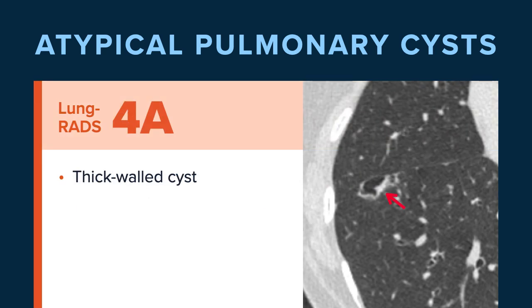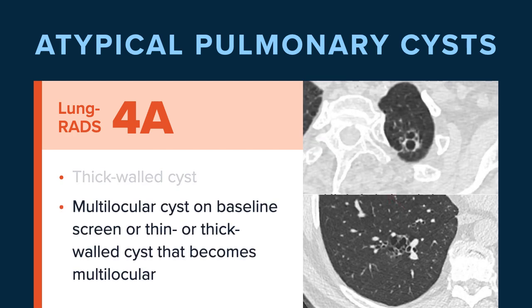IV-A lesions are thick-walled cysts. As we see in this example, we have a unilocular cyst that has a thick wall of more than two millimeters — this is a thick-walled cyst and it's a Lung RADS IV-A. Multilocular cysts are also IV-A lesions. We can identify two different examples here of different multilocular cysts — these are suspicious lesions classified as IV-A. They may be initially multilocular, or they may be a previously thin or thick-walled cyst that was stable and then develops loculations or internal septations, which will then be classified as Lung RADS IV-A.